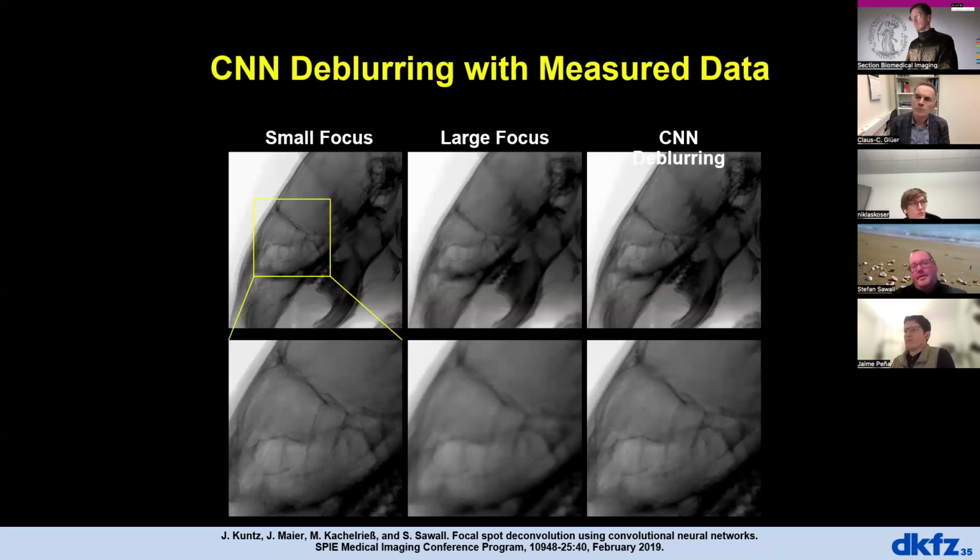If it comes to at least denoising methods, you can inject measured data with artificial noise. The noise properties of CT systems are well understood. They can be well calibrated. This also, for example, not only includes the photon statistics, but it also includes correlations between detector pixels and things like that. And these simulations are quite good. So what researchers usually do is they use data that were acquired with a rather high dose for certain clinical applications, and they simulate artificial noise into these data. And this allows them to basically train their neural networks. And I think this is a viable method to go about this.